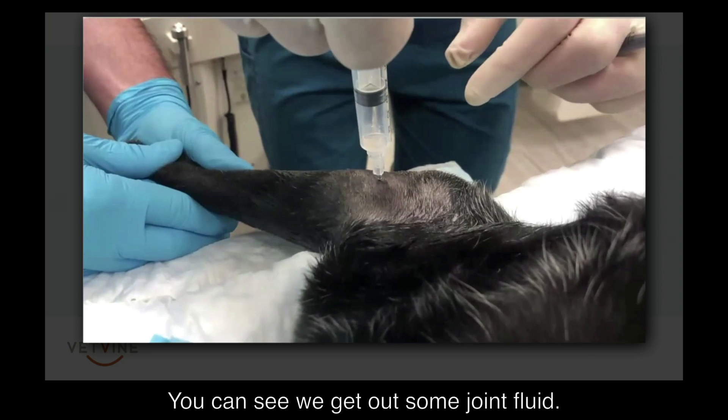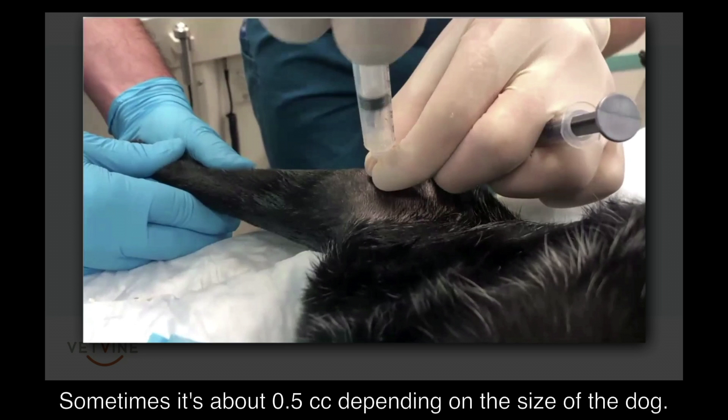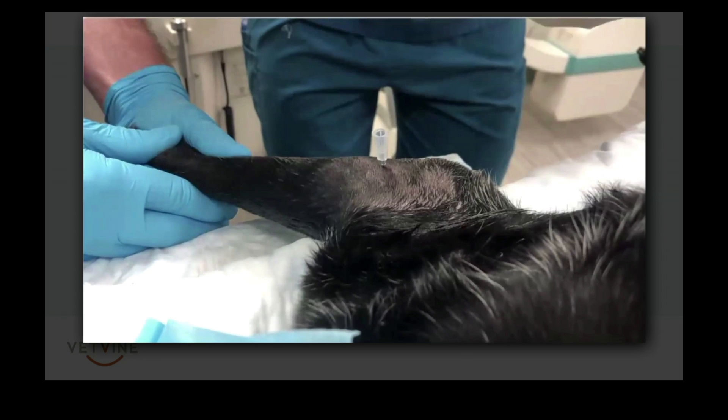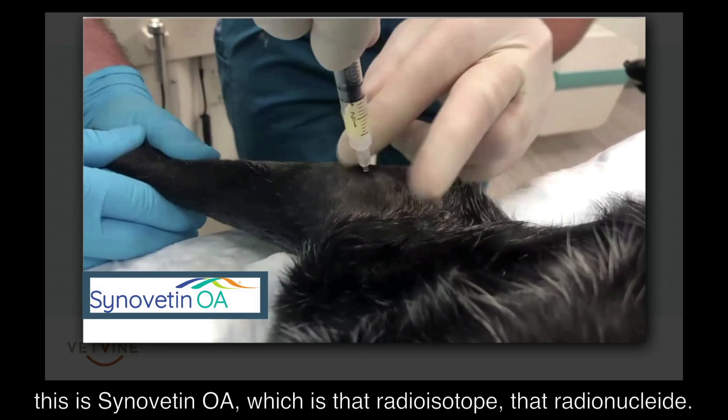You can see we get out some joint fluid — sometimes it's about a half cc depending on the size of the dog, sometimes we'll get more. There's a little stringy viscosity to it.